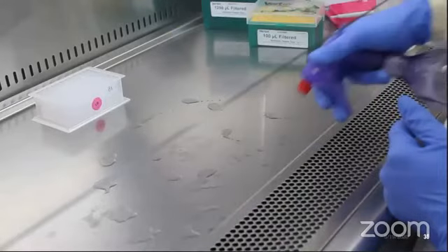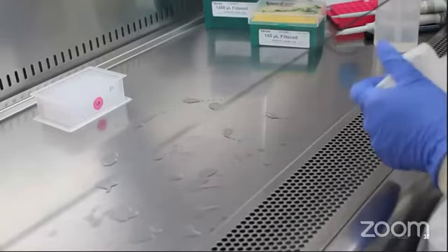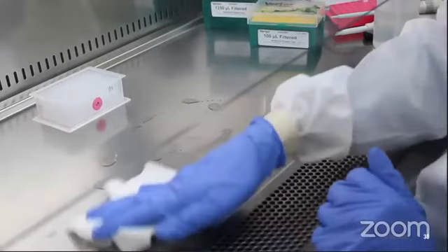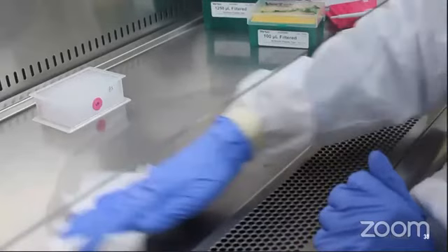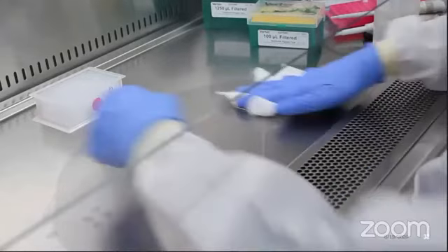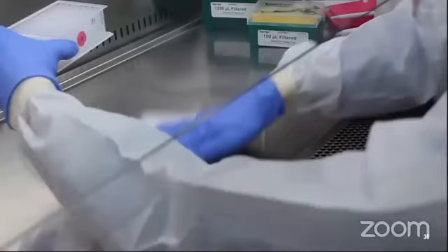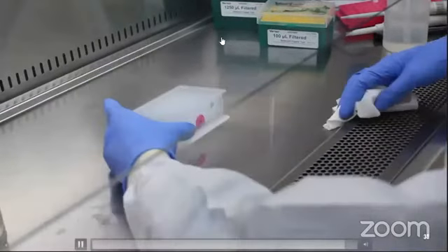Once again, wait for some time for the disinfectant to work. Wipe out the area one more time.